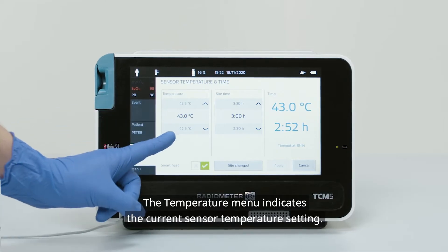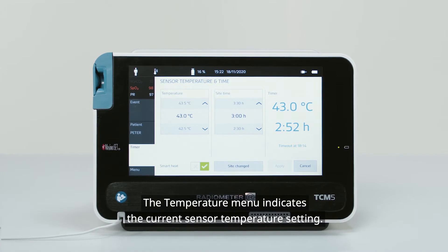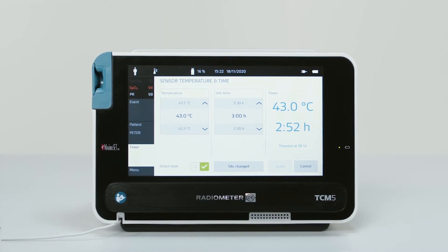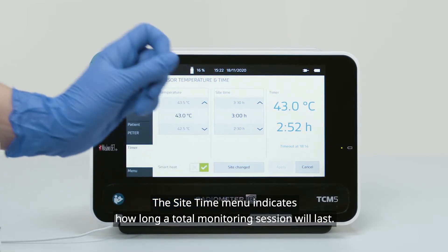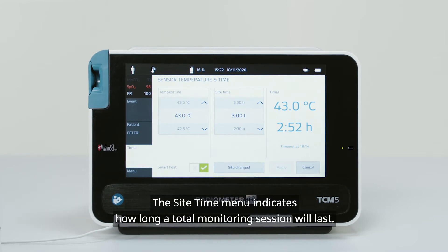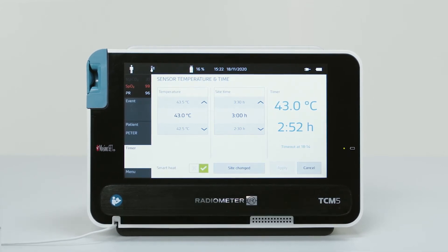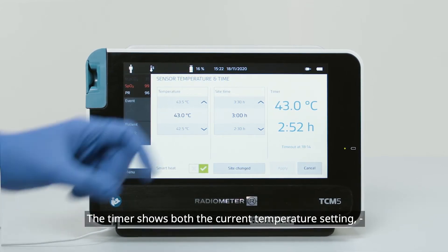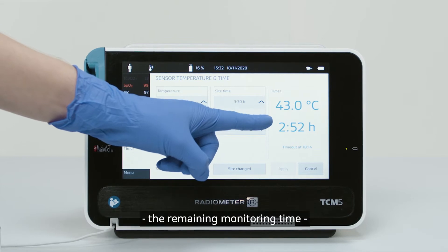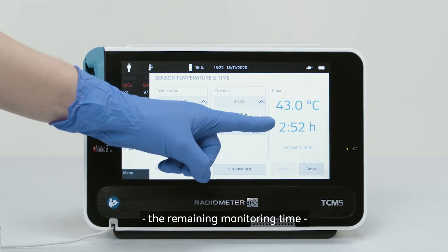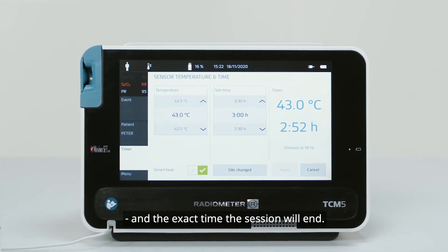The Temperature menu indicates the current sensor temperature setting. The Sight Time menu indicates how long a total monitoring session will last. The timer shows both the current temperature setting, the remaining monitoring time, and the exact time the session will end.